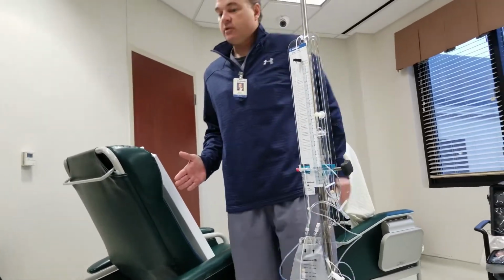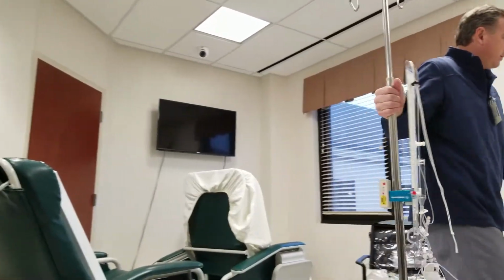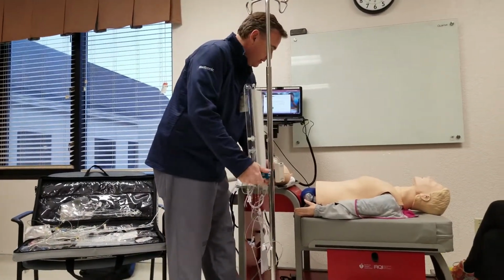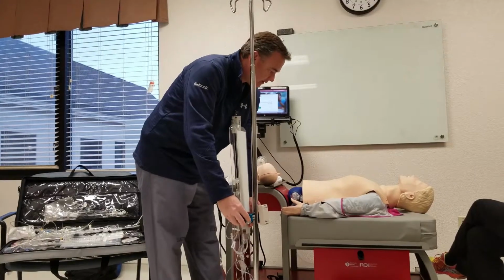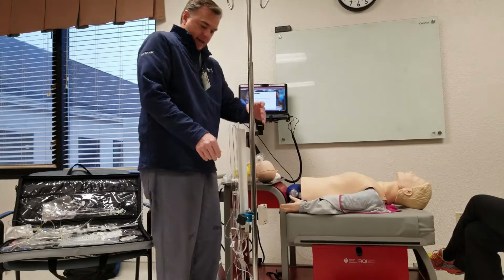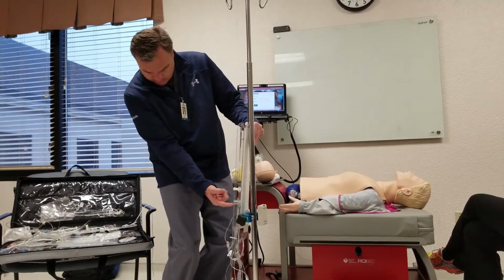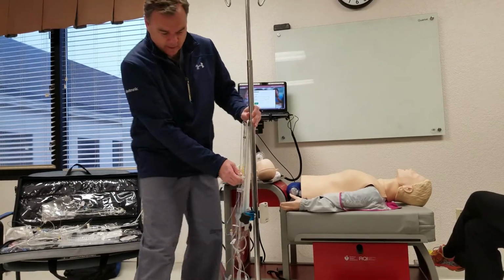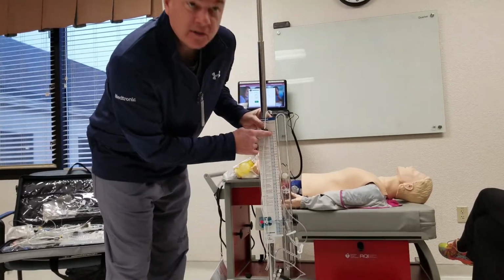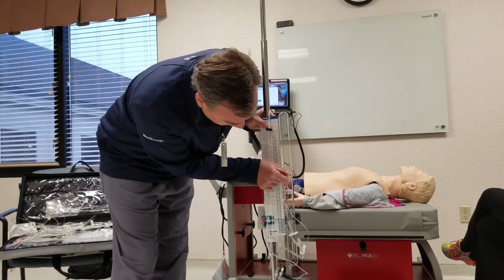You would want to see that laser on if I was lying horizontal. Let's say this is our patient. This is actually pretty good right here. The lumbar puncture site is right there, we're lined up, and it's written at 8. We're going to slide this down. Let's say we're zeroed out, and it's written at 8 right here. We're at H2O, water, 8, and we want it to line up with that.